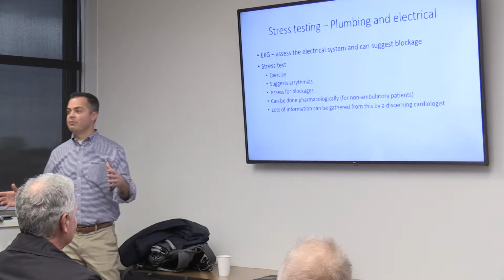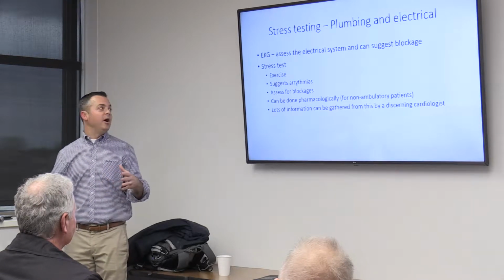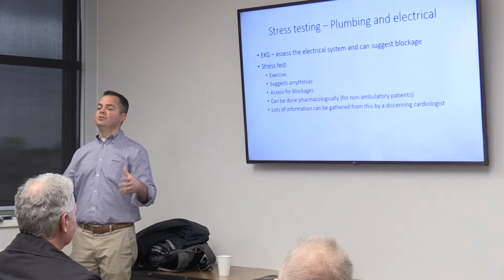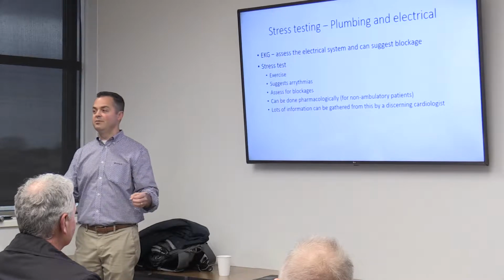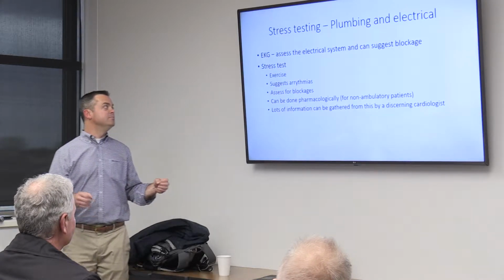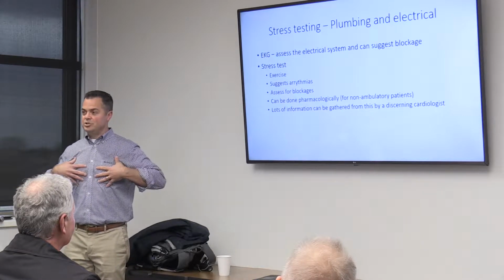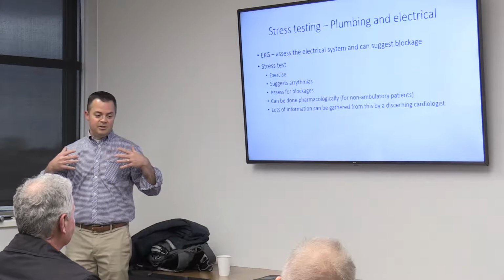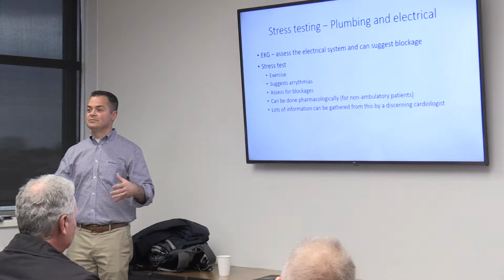Okay. So this is pretty common. Stress testing. Everybody knows what this is to varying degrees. Stress testing is mostly designed to look for blockage disease. Okay, so we're talking about plumbing disease now. And it starts with a simple EKG, which you should have done before you would do a stress test, because you don't know what kind of stress test to order unless you do an EKG.